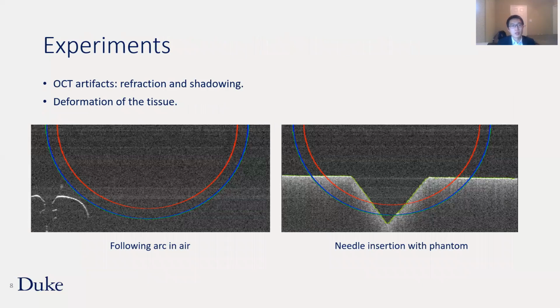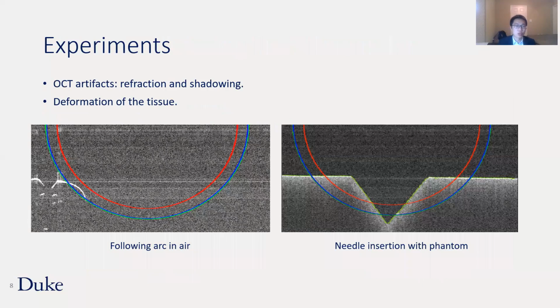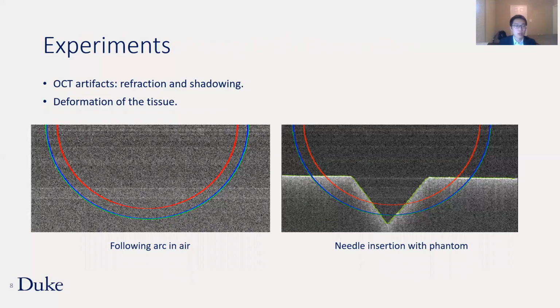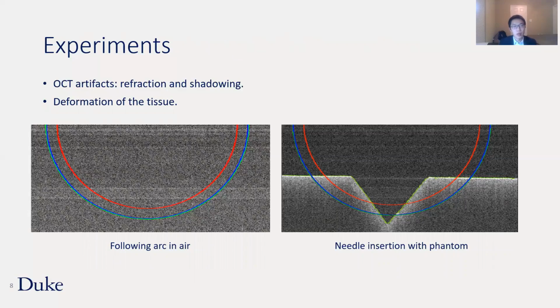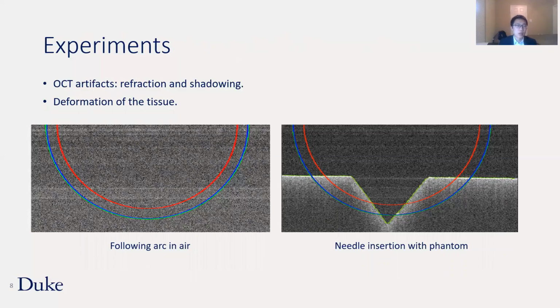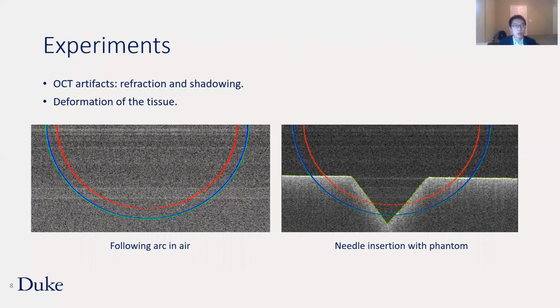In the experiment, firstly, we let the needle follow the arc in the air. In this video, there's no suturing target. We need to check whether the needle follows our desired suturing path. The red curve is the needle's desired inside surface path. The green curve is the desired needle tip path.